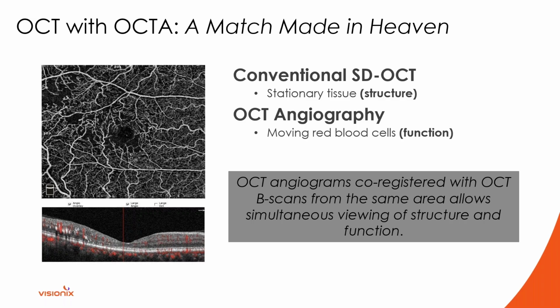It's the same idea if you were to take a picture of a waterfall. If you were to take one now, 10 minutes and 15 minutes later, those pictures are going to look very different. So these are two very different technologies that really you have to look at together and in sequence to understand. And we'll go into more detail in just a minute with what that means. So on the left-hand side of the screen, you'll see on the top the angiogram, and once again, the corresponding B-scan on the bottom.